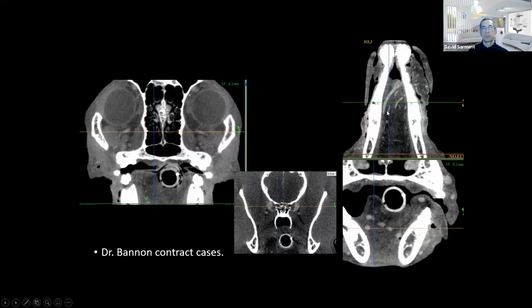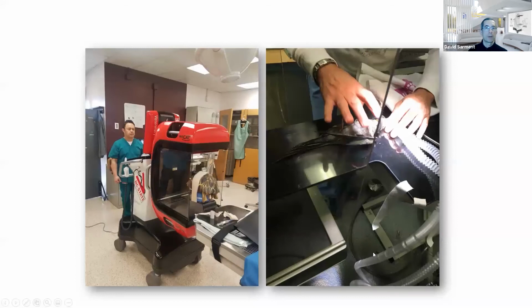The question is, does it perform beautifully, or does it perform enough for the purpose? And it seems that the experience is not huge. We don't have a ton of cases done with contrast CTs, but from what we've seen, the clinicians who have done it show that the image output is actually useful and lights up the tumor when you need it to. There's lots of other applications. We've just touched on a couple of points today. Of course, one of them is exotics, small animals, where very thin, hollow bone will actually show well on cone beam CT, again because of this high resolution in the bone window.